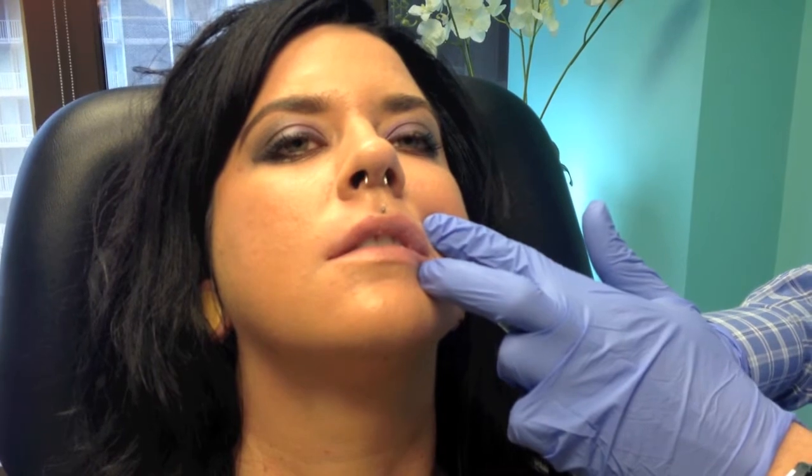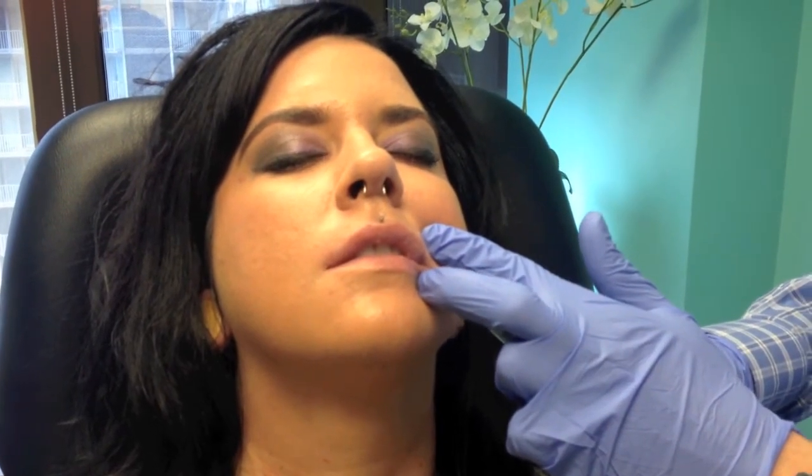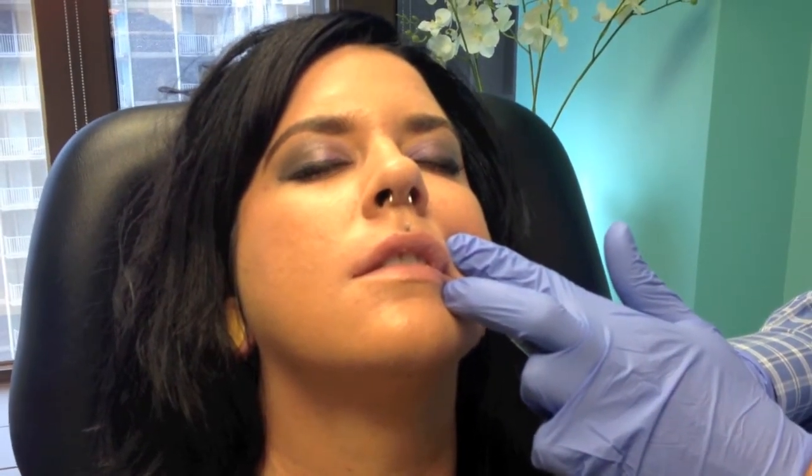How bad was that? It didn't hurt at all. Good. For a right-handed surgeon as well as a left-handed surgeon, there are going to be various techniques — you have to adjust from side to side. Penetration is the one she'll feel the most, and then little by little you're advancing slowly. Don't jab it in — it's not good form. Go slow.